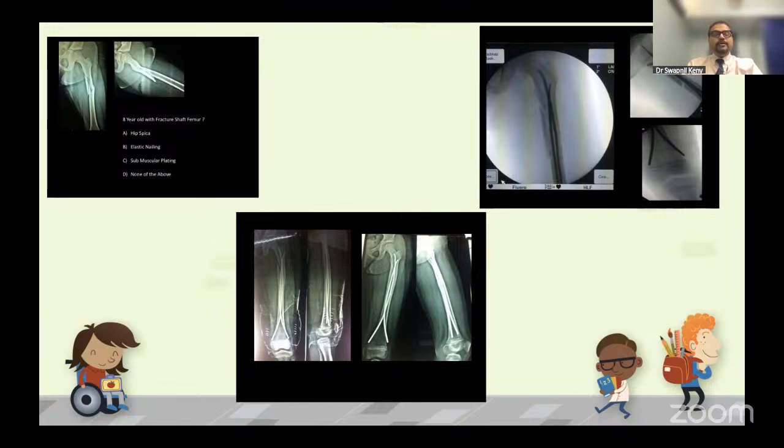What you need to remember very clearly and carefully is that you have to follow the principles of elastic nailing. And what are the principles of elastic nailing? The principles are two nails of equal diameter bent in a C-shaped fashion, passed from the metaphysis from diametrically opposite points across the cortex. They get a complete cortical contact, provided the spindle which is formed between the two C's is at the level of the fracture site, and with a good distal metaphyseal fixation it gives you a 6-point fixation. So that is the elastic nailing principle.